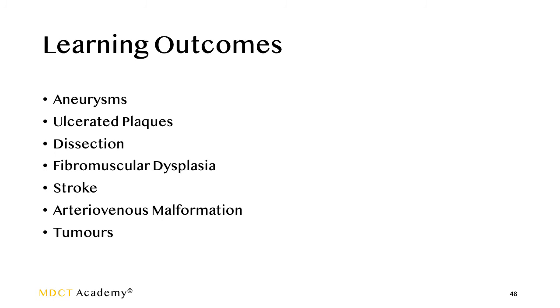Remember, carotid CTA is not just about the vasculature — it encompasses infections, dissections, ulcerated plaques, carotid webs causing thrombosis or TIAs, and tumors including paragangliomas and nerve-based tumors such as schwannomas and neurofibromas. In this lecture we have looked at aneurysms, ulcerated plaques, dissection, fibromuscular dysplasia, stroke, arteriovenous malformations, and tumors.